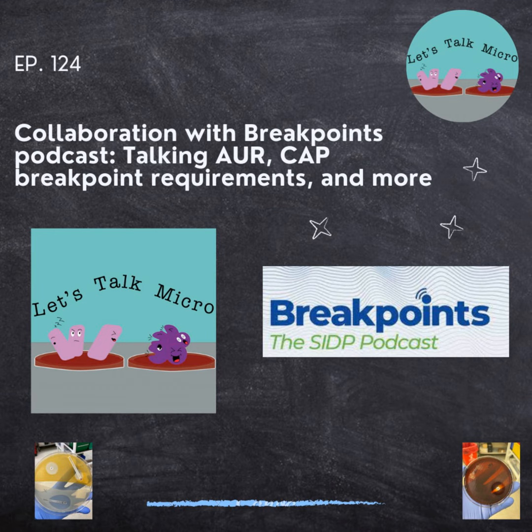One of the interesting things we are actually validating is not the MIC, but the interpretation, the breakpoint itself. So a validation process with a categorical agreement is sufficient to be in compliance with the validation process for this new CAP checklist. So we need to make sure that the interpretation that we're applying to the result is following the new or the latest publication for that breakpoint.